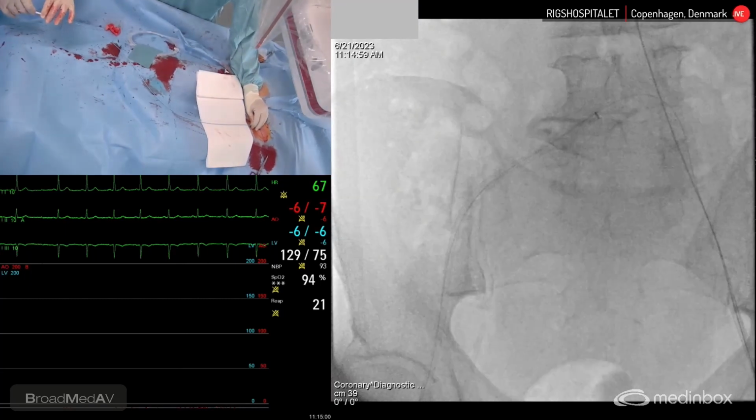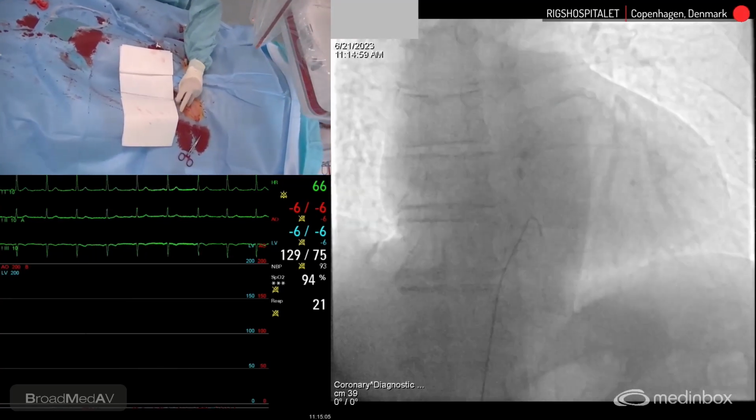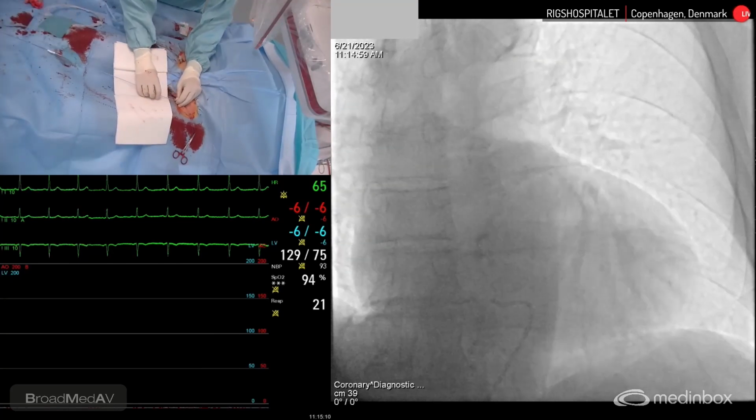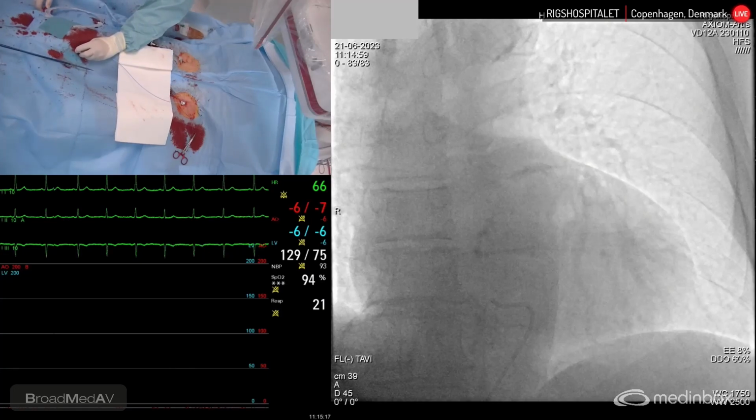We're going to scale up to the eye sleeve. That's the 14 French eye sleeve, which is the sheath that's suitable for and used with the Acurate platform. You're going to need the stiff wire here. Heparin is given. Because the patient has calcium everywhere, access, aortic arch, very calcified leaflets, we're going to use some cerebral protection as well in this particular case.